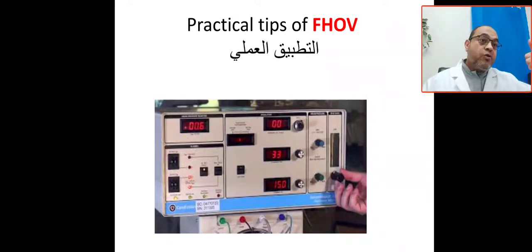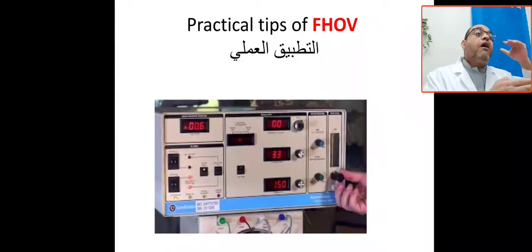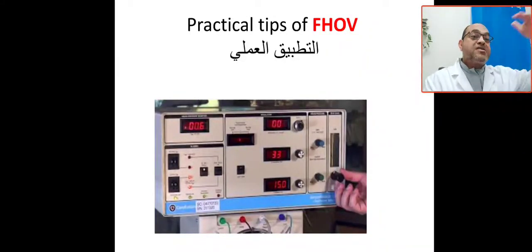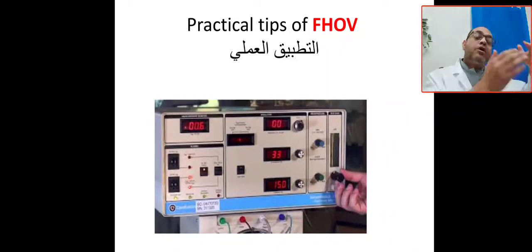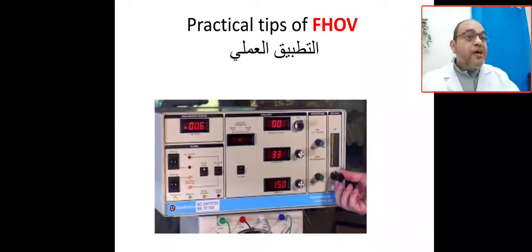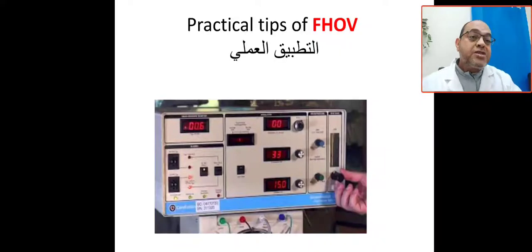So this is oxygenation failure or ventilation failure. The patient is actually accumulating CO2 on conventional mechanical ventilation on the high setting. You reach a higher setting and still the patient is accumulating CO2, cannot eliminate the CO2. This is an indication to shift the patient from conventional to high frequency, or perfusion problems or air leak. So your decision to shift this patient from conventional to high frequency is due to conventional mechanical ventilation failure and high frequency as rescue. What are you going to do?